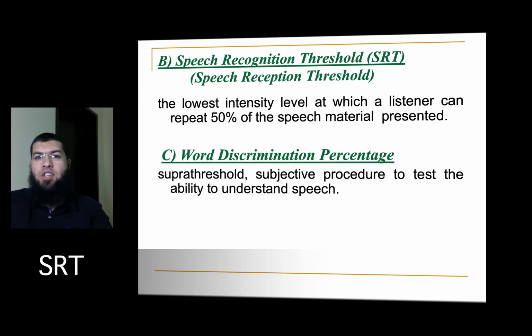Speech recognition threshold, or speech reception threshold, is the lowest intensity level at which the listener can repeat 50% of the speech material presented. The word discrimination score is a supra-threshold subjective procedure to test the ability to understand speech.